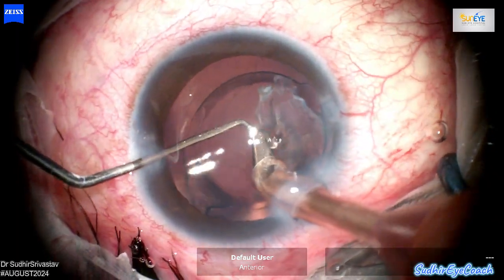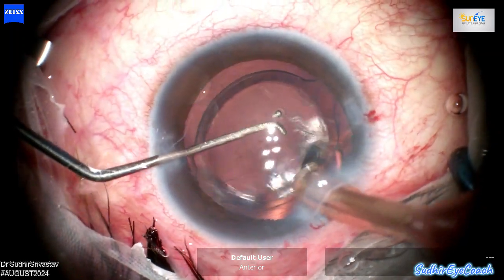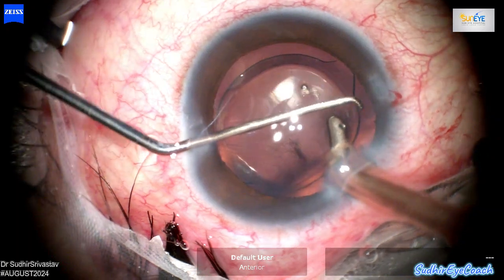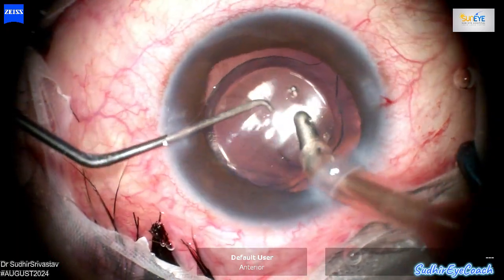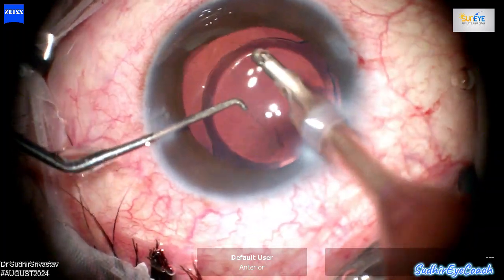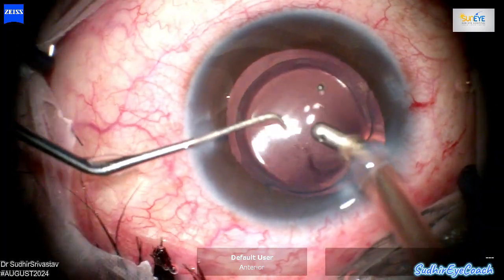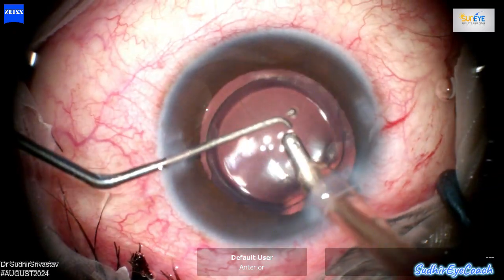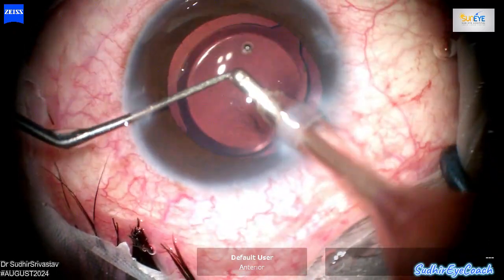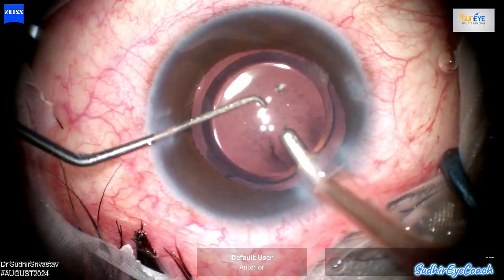Before entering the I/A in the anterior chamber, I further reduced the intraocular pressure to 20 mmHg to minimize stress on the posterior capsule and to prevent vitreous from coming out through the posterior capsular hole. Now the IOL is well-centered in the bag and the posterior capsular tear has remained stable. Through careful maneuvers, I ensured that the tear did not extend and no vitreous has entered the anterior chamber or come through the tear.